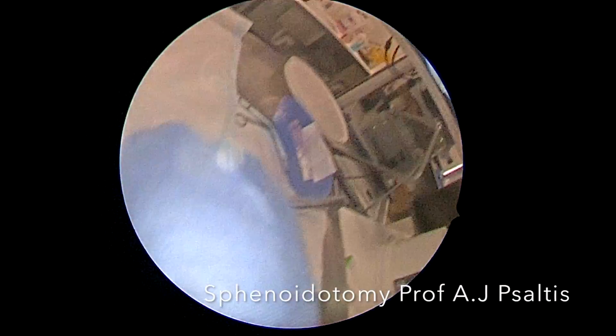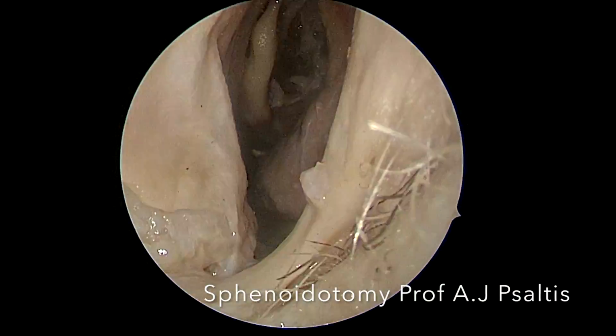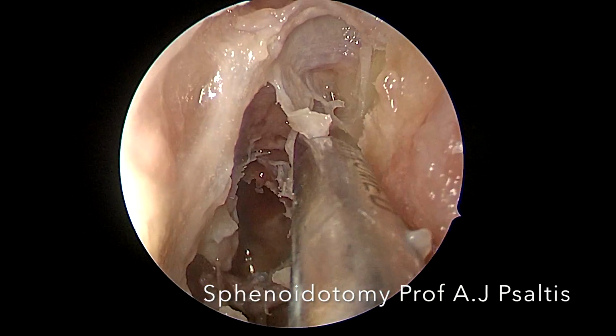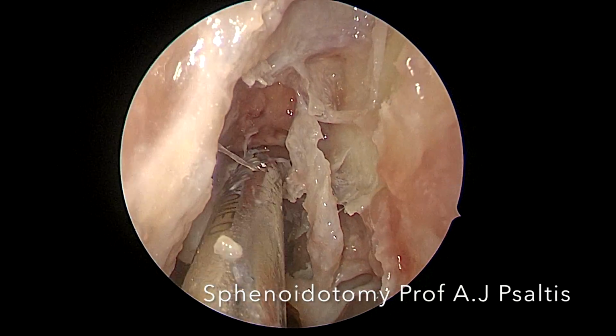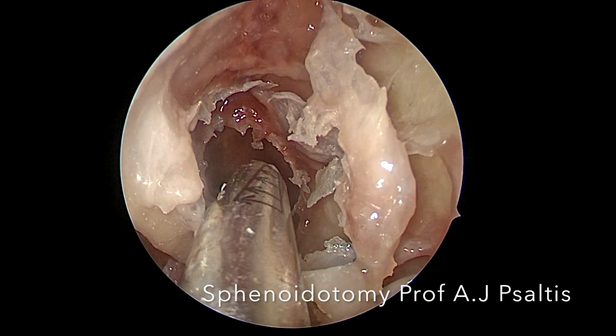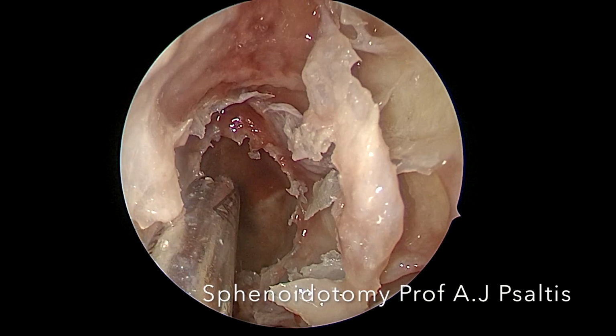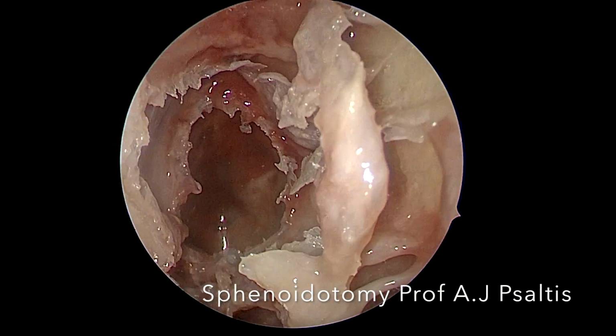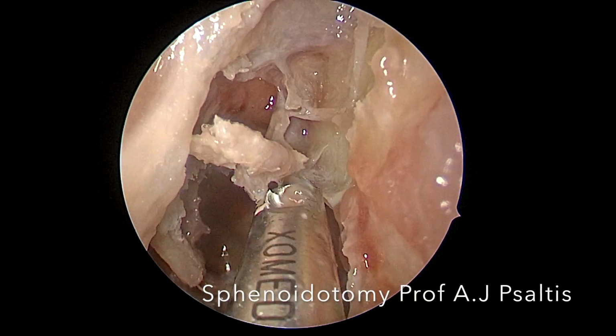A microdebrider or a 45-degree scope can then be used to visualize the entire skull base, and a microdebrider can be used to remove the remaining soft tissue. Here we can see that we can safely debride the lateral aspect of the superior turbinate, as olfaction is located on the medial aspect.